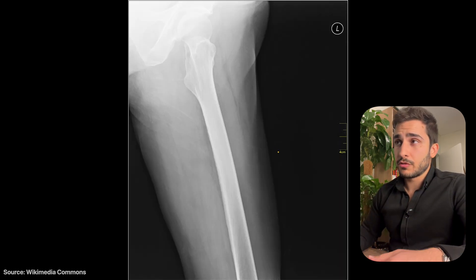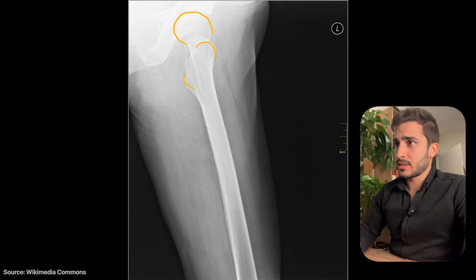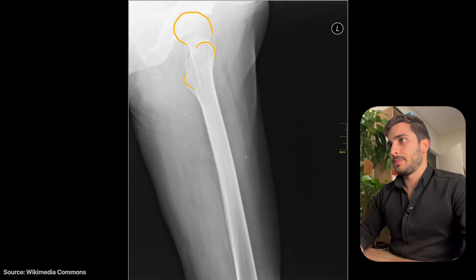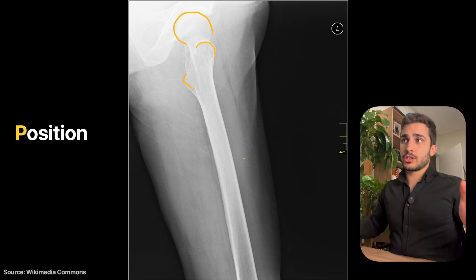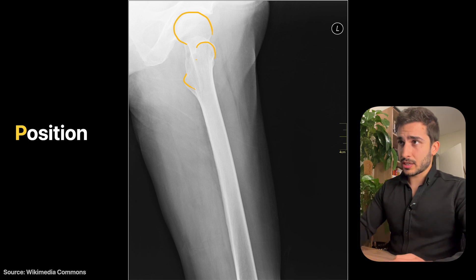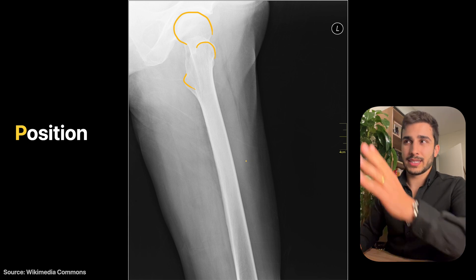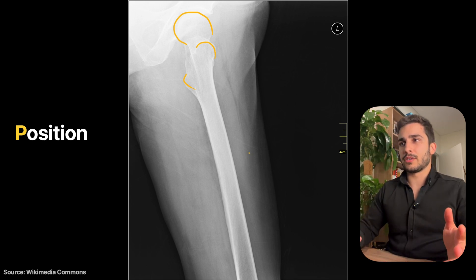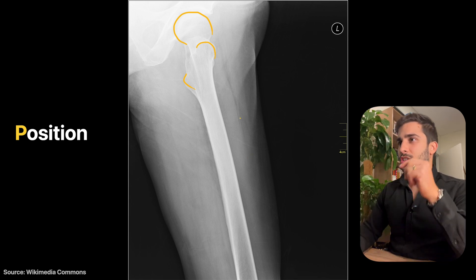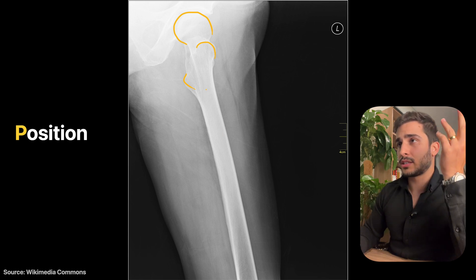Now we're looking at the lateral view of the proximal femur. We can see the femoral head, the greater and lesser trochanters, and the rest of the femur below. This view is actually really well done — when you turn the patient to their side, they're naturally at a slight angle, and it's very hard to get the lateral femur perfectly in line with the detector without having half the patient's body off the table. Positioning is quite nice and the hip joint is well included.